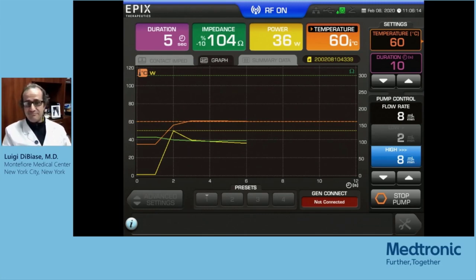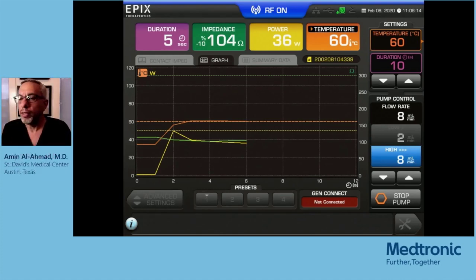You will see the signal melting there, and the catheter works very well. Like I said, I know you don't have the arrow, but on the ridge, I showed you it's incredibly stable. And because the temperature is recorded all around the tip of the catheter, you're getting a decent temperature recording. So I'm getting 60 degrees on the ridge. I don't need to know the arrow because I already know that I'm in good contact, because I'm achieving good temperature and good impedance. So it's really pretty straightforward.